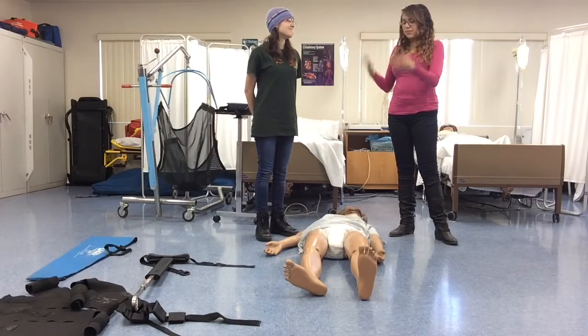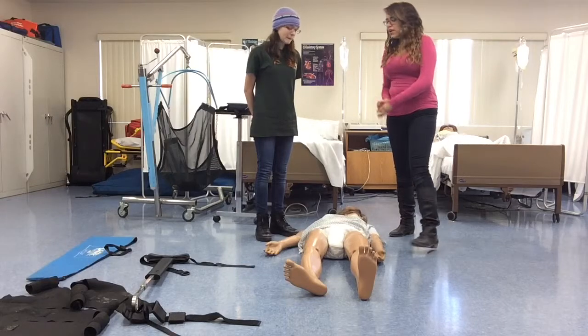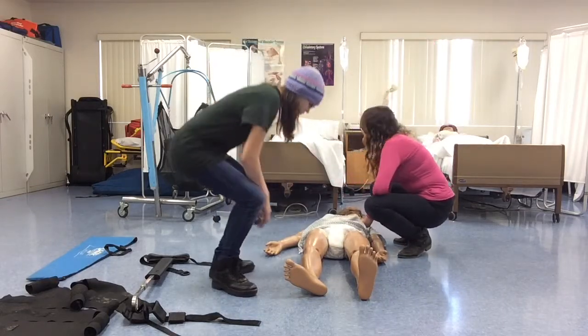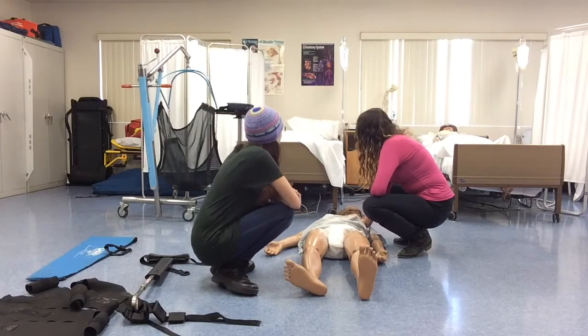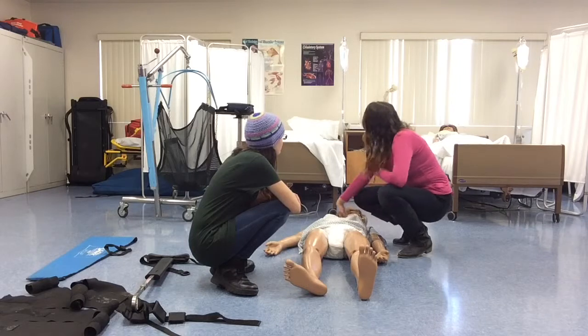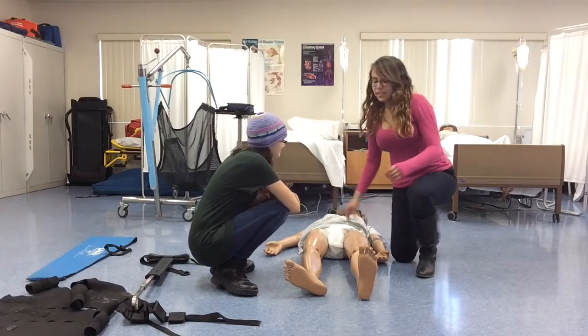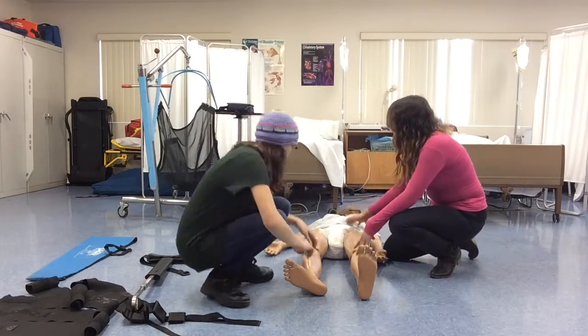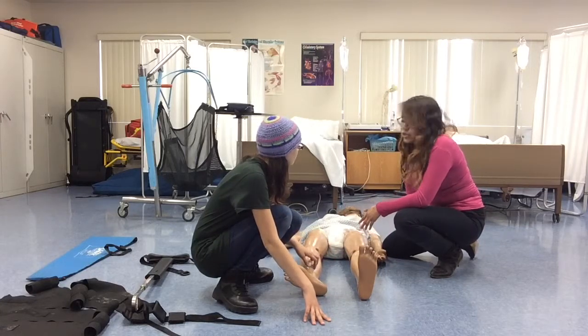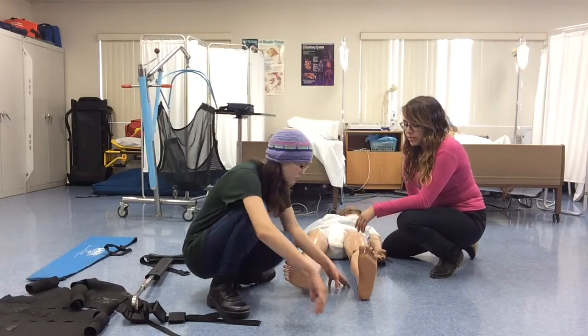I'm safe, my partner's safe, the patient's safe, so the scene is safe. So, hi ma'am, my name is Denise Garcia. This is my partner, Ariana Jones. We're EMTs. Can I help you? Yes. What seems to be the problem? I think I broke my leg. Okay. So, exposing the area of her injured leg, I see it's a mid-shaft femur fracture, nothing else. So, Ariana, can you stabilize her leg for me?